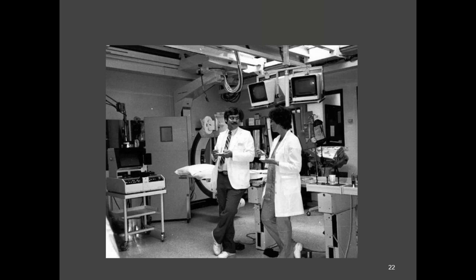Okay, so in this vintage of lab, as well as the older ones, you would have had a pickup tube. Basically, a pickup tube is an old video camera, like you would have seen when the TV crew showed up with cameras this big on big wheeled stands. The radiologists won't want to admit it, but I know the PAs would still have a couple of old systems with pickup tubes in them. The image quality is actually better with these old timers than with the replacement. The only bad parts are they take a long time to warm up, and they're very temperamental. When they work, they're really good, and when they don't, no fun.